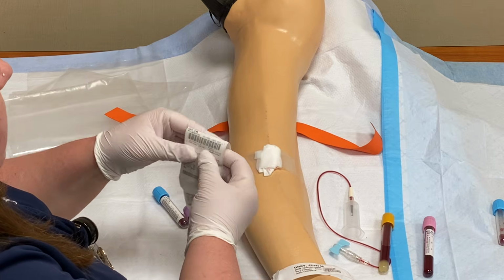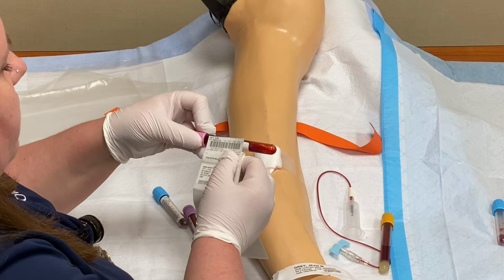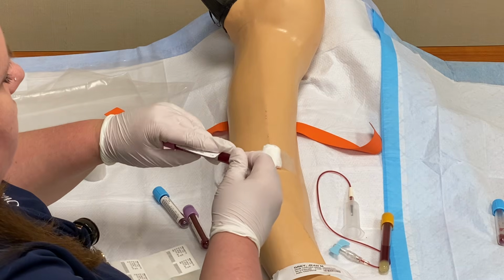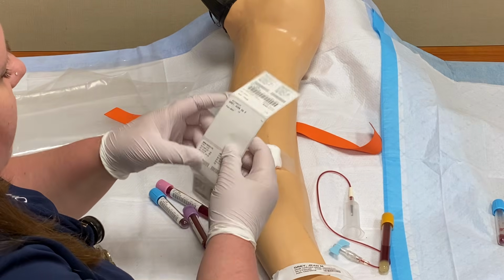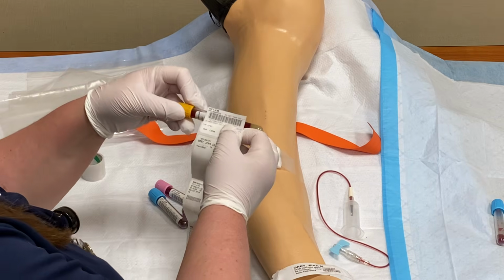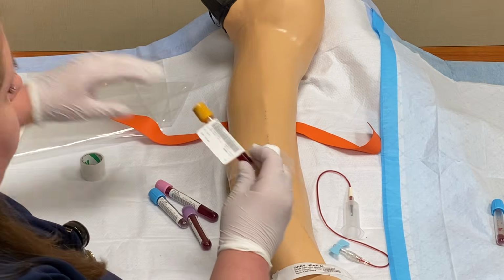Next I have my pink. This one's a long tube, so all I have to do is cover the manufacturer's label. And my final tube is my gold. Again, a long tube. So I'm gonna put that label on there.